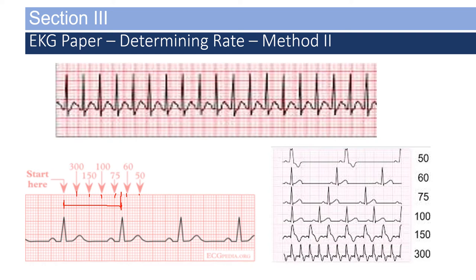Let's try that on the strip at the top of the screen. Find the start point — it has no number — then go to the next box: that's 300, and the next is 150. So this R-wave falls directly between 300 and 150. Between 300 and 150 is a difference of 150 beats; divide that in half to get the mean of 75. Add 75 to 150 and you get 225. You can say with reasonable certainty that this rhythm is approximately 225 beats per minute.